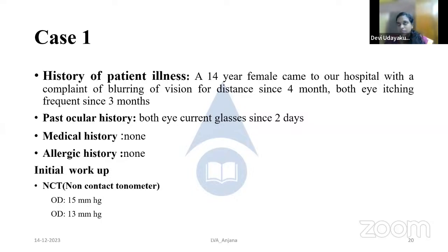The next point is about the contrast sensitivity chart, which you mentioned is only one chart. There are different charts and different screening charts available. The Pelli-Robson chart is one chart. So you can explore and have a list of charts. This Pelli-Robson chart itself is a chart of alphabets. When it comes to a person who is not able to identify an alphabet, or in very young children, you can use some number charts, which are like screening tools, and contrast sensitivity tools are there. You can do that. And there are also recent advancements in the field of contrast sensitivity, where you can even use apps for testing contrast sensitivity in children. So find out about it.